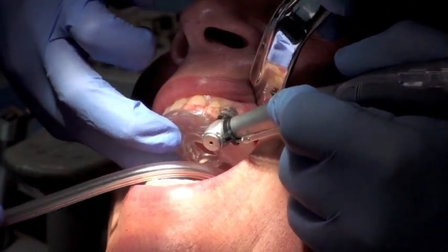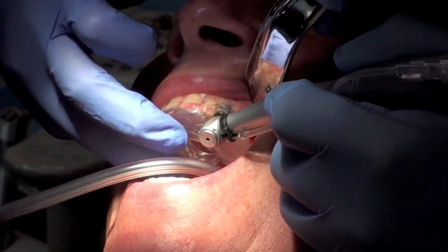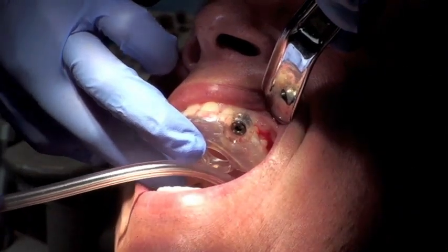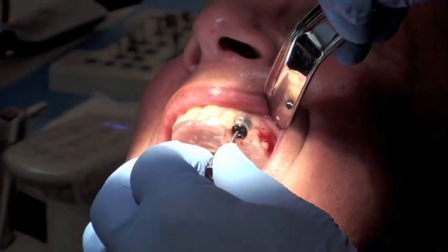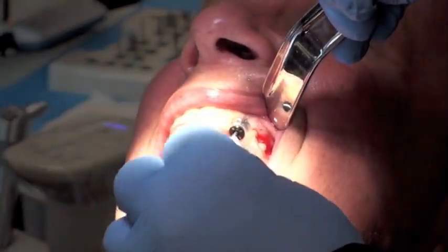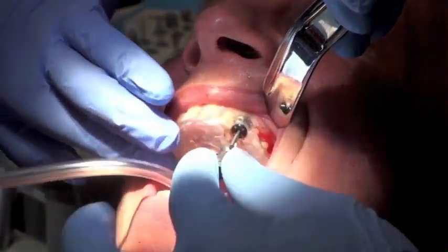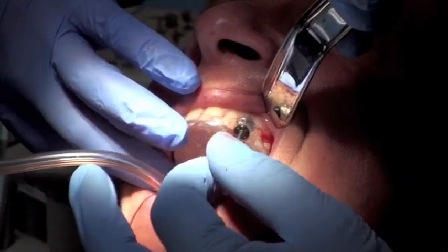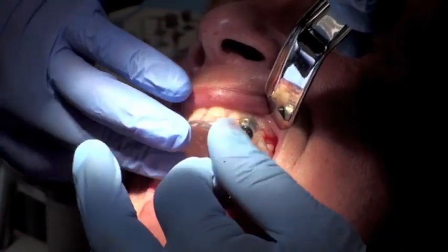Once the implant has been placed to the perfect depth, there's a quick release that allows me to disengage the handpiece from the implant complex. At this point, I can unscrew the implant holder to the implant. This is absolutely critical, otherwise if a surgeon were to try or attempt to remove this surgical guide, the implant would come out with it.